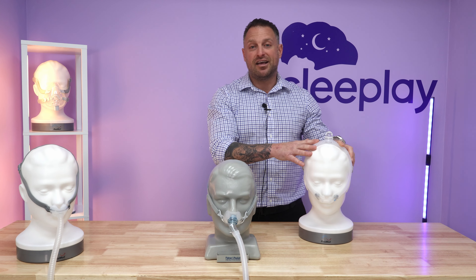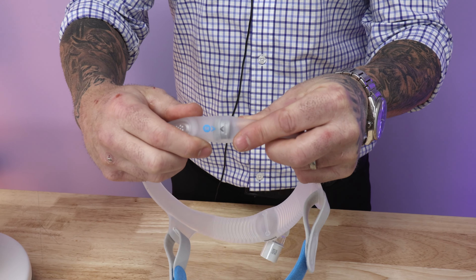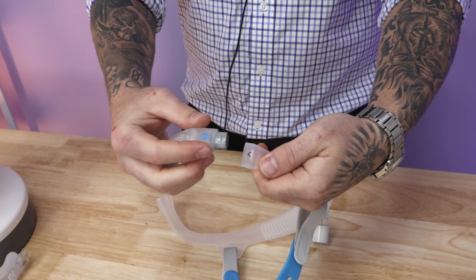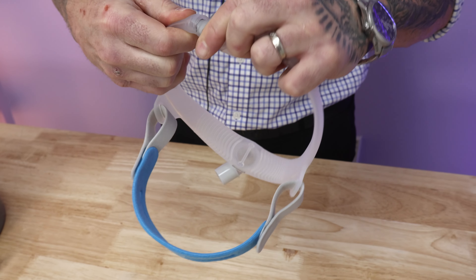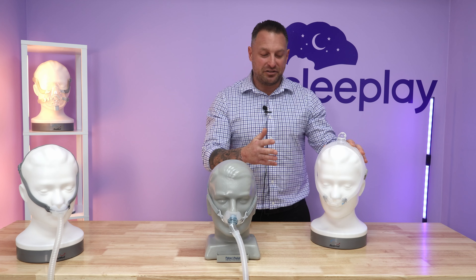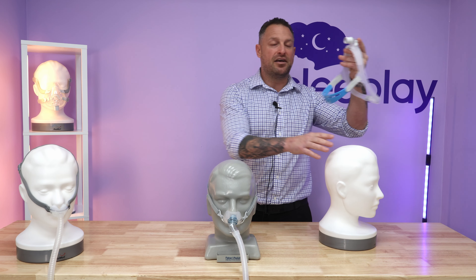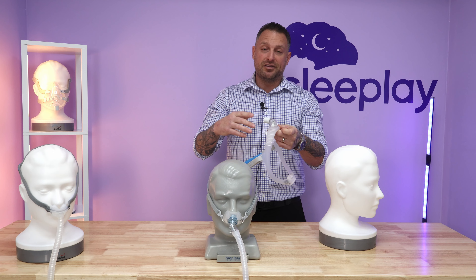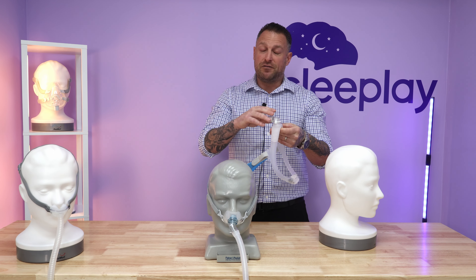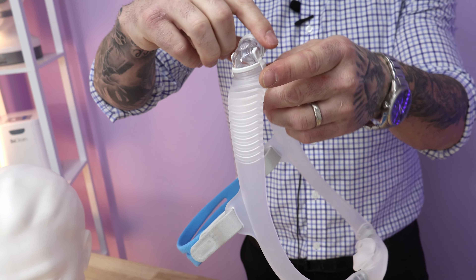This cushion is actually interchangeable with the N30i, which is great. If you want to switch masks, you don't have to buy the whole mask again — you could just switch the cushions and they interchange with each other. This mask has the connector on top of the head and doesn't have the extra foot of tubing, but it comes in handy for some people. If you do toss and turn a lot, you might be better off with a mask like this — that's what it's made for. It does swivel, so you can move around.